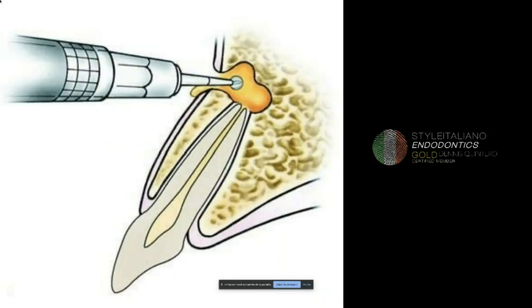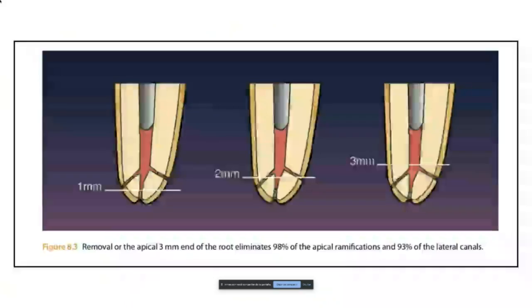A really microscopical surgery. We are going to apply all the same management that we will do for an apical surgery, but in this case it will be different because we don't have an apical portion of this root. Basically, what we have is a middle third of the root, okay, because of the resorption. So if this tooth is resorbed of the middle third of the root, it will be very wide, okay?